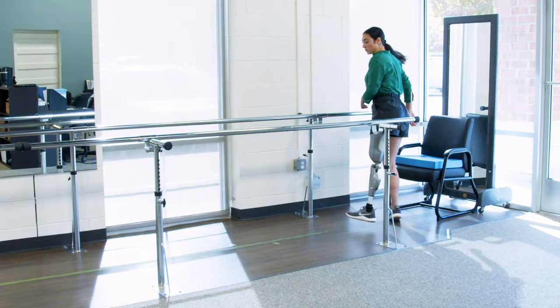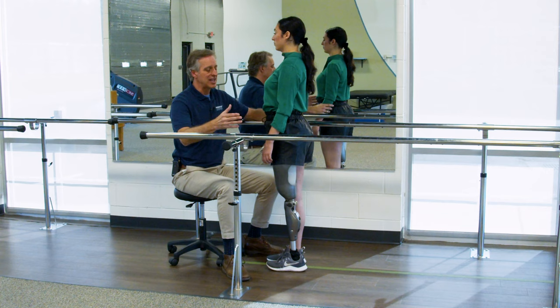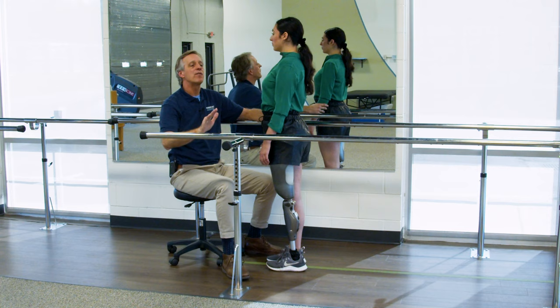Excellent, come on back. Long stride, stretch it out, stretch it out. Nice, hold up right there, nice. Now, one way to get someone to learn how to do this from the very beginning is this sense of when you're stepping out there, it's almost like crossing a creek with stones, and I almost have to take a little hop to the next stone. It kind of forces you to take that little bit of leap of faith.